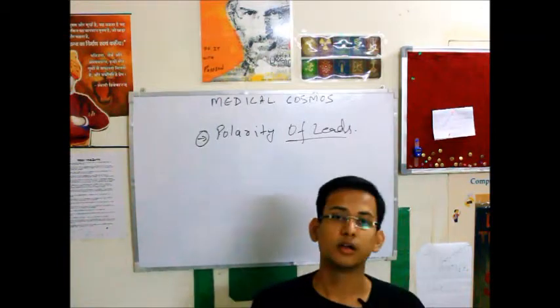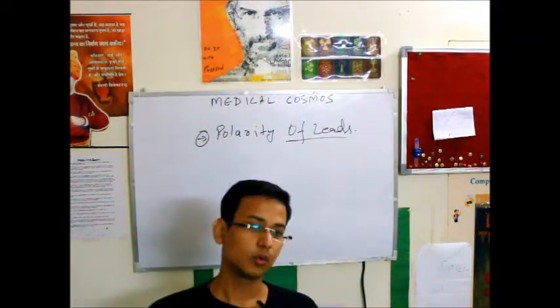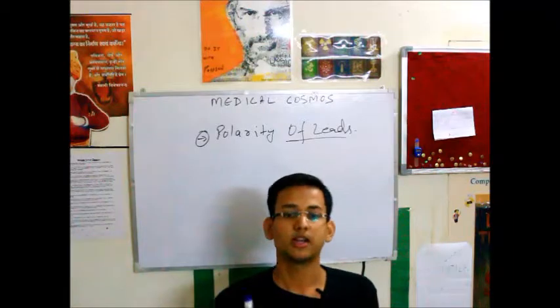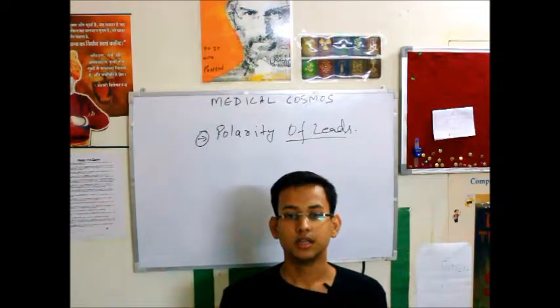Here we need to pay attention that there is a midpoint between them, when the depolarization wave is perpendicular to the lead, and that is equiphasic potential.